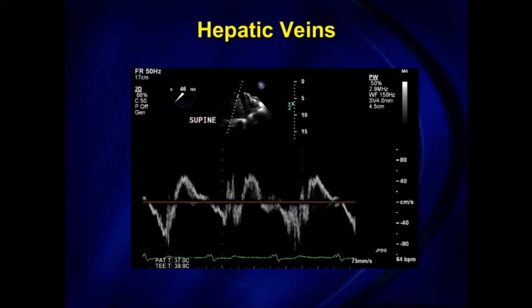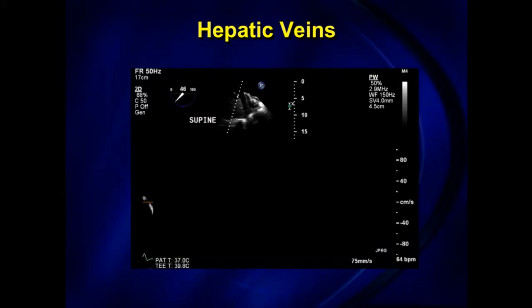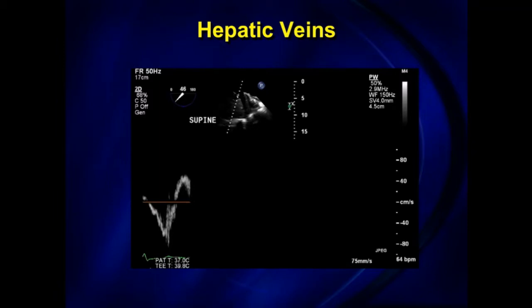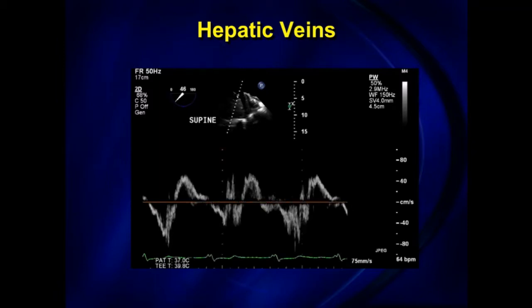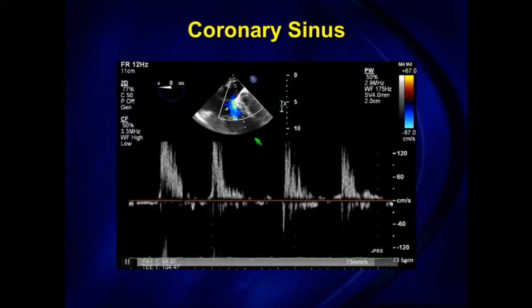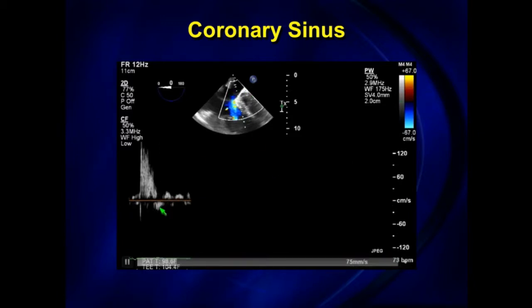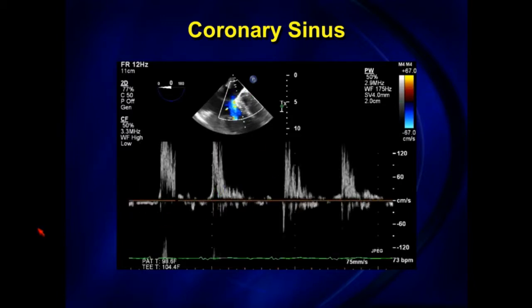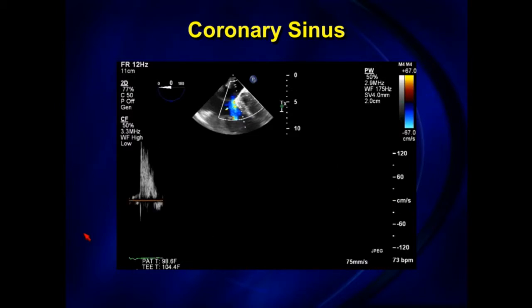Don't forget — from TEE you can view the IVC. If you go a little deeper you can see the hepatic veins and document hepatic vein reversal. This patient had a huge coronary sinus and torrential TR and actually had systolic reversals in the coronary sinus as well, analogous to pulmonary vein reversal.